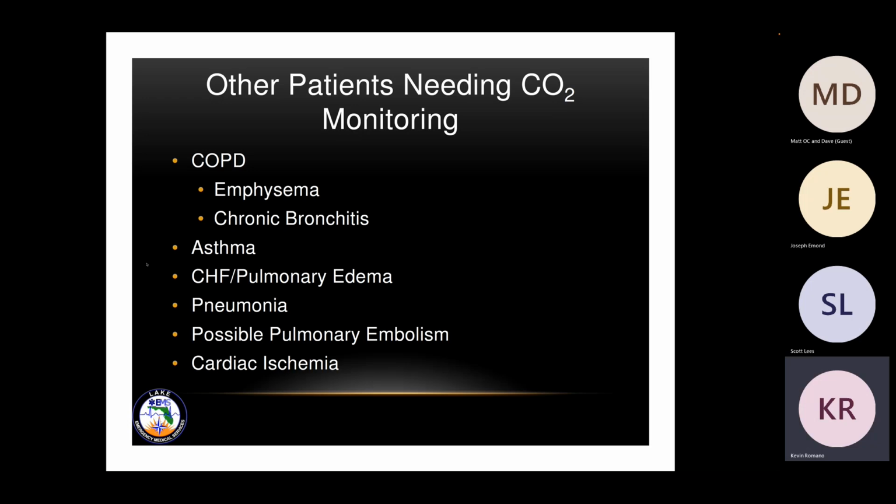Other patients that need CO2 monitoring are going to be your COPDers, emphysema, bronchitis, asthmatics, CHF, pulmonary edema, pneumonia, a possible PE, and cardiac ischemia. So I've done this class before, and I know that Scott sat through this before as well. And I'm glad he's sitting through it again because it's a good refresher. He mentioned to me after the fact, so we're basically putting an end tidal on everybody. And he's not wrong. Most of the patients we have should have a minimum of nasal capnography for the patients that we're seeing that are sick. It also includes septic patients, so sepsis patients should also have it on as well.